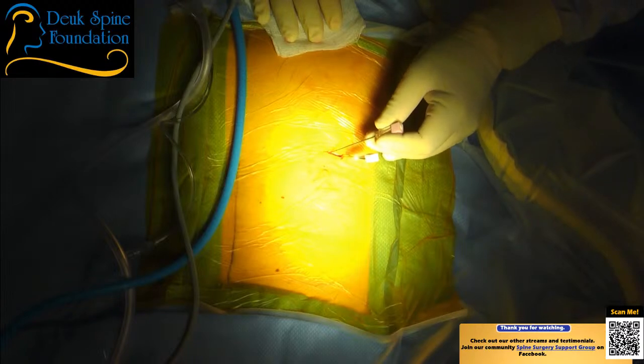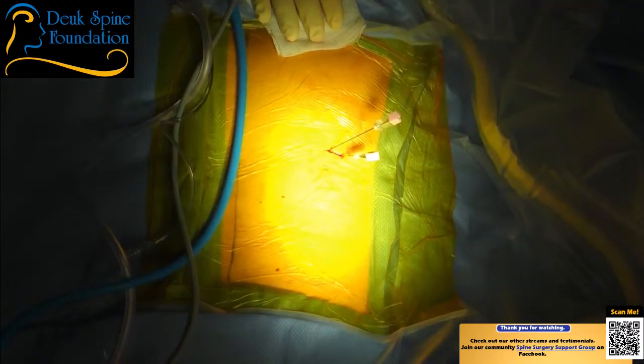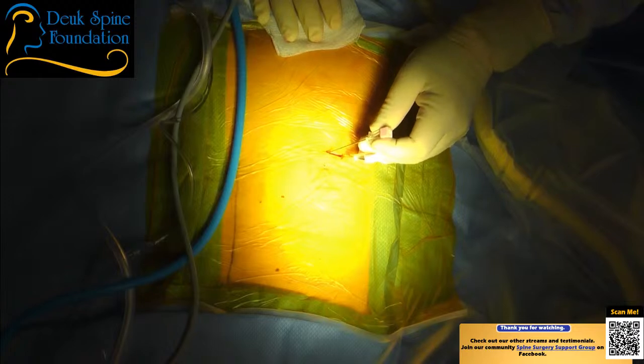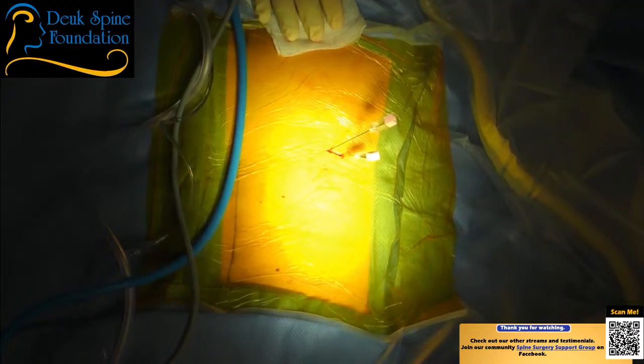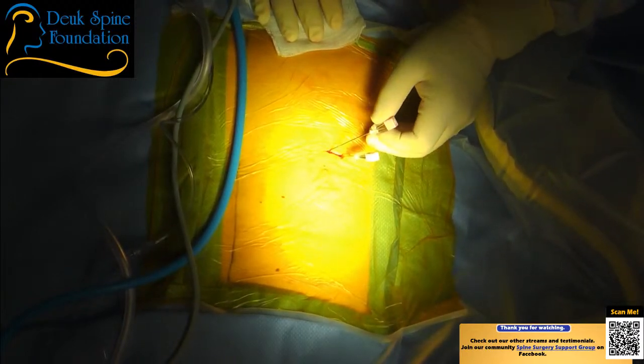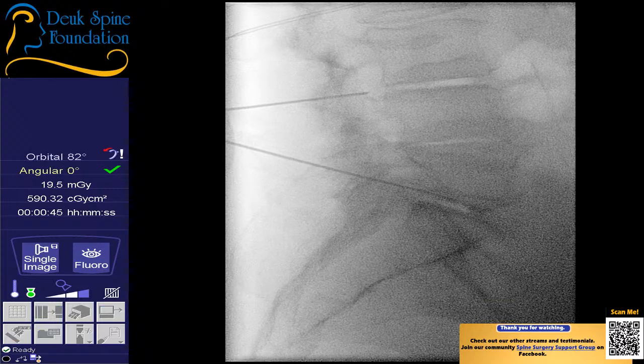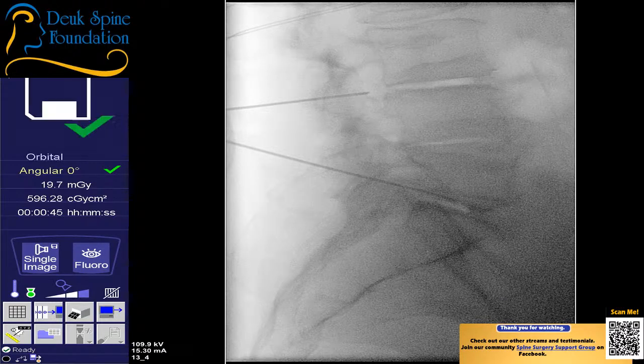But I'm feeling the facet joint. Perfect. Let's see. We're just taking our time, finessing. Now I feel like I'm in the foramen. I feel a herniation right there. So let's get an AP. I think it's a herniation. Let's see where we are before we go any further.